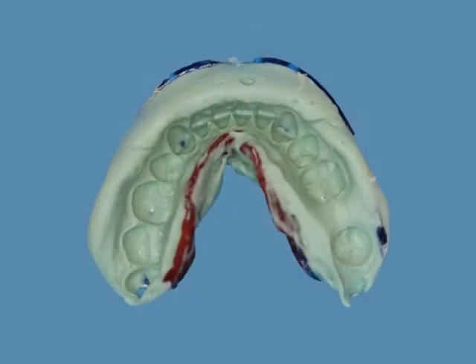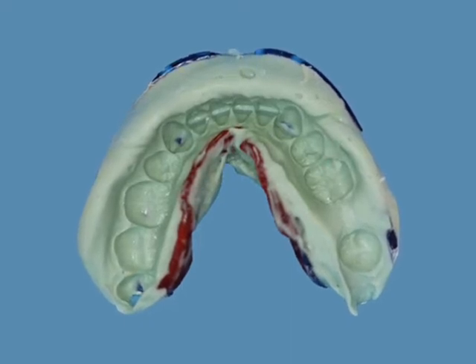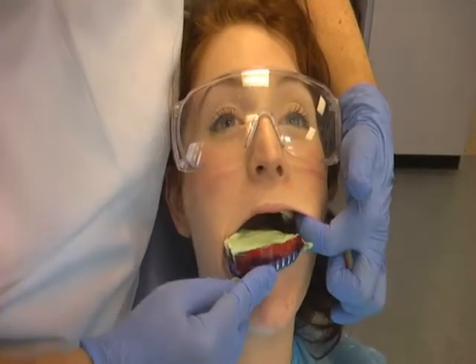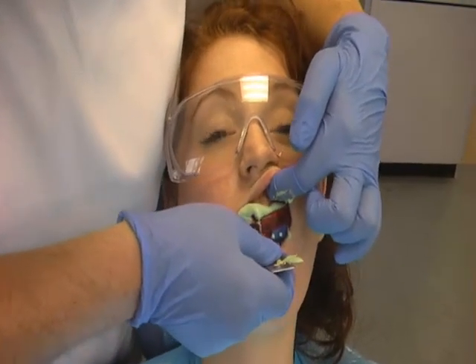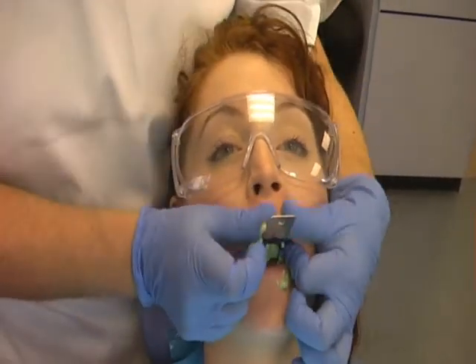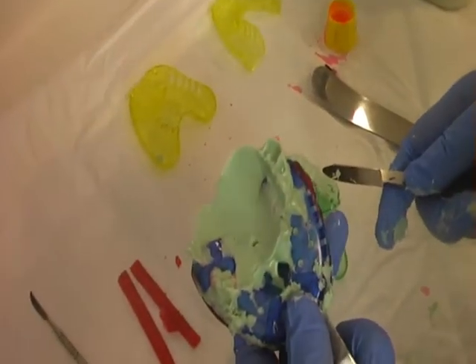Thoroughly mix the alginate and load the upper tray. You can stand behind the patient to insert it. Make sure it is in the correct position and fully seated. If you happen to have a patient that has a sensitive gag reflex you must explain fully the procedure. Reassure them and advise them that deep breathing through their nose may particularly help. To achieve a detailed impression it is very important that you manipulate the lips and cheeks around the impression tray as the alginate impression is setting.